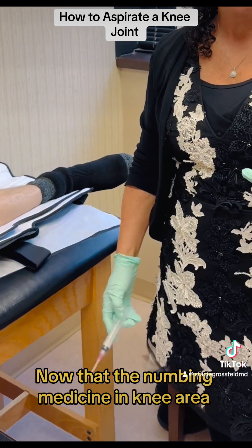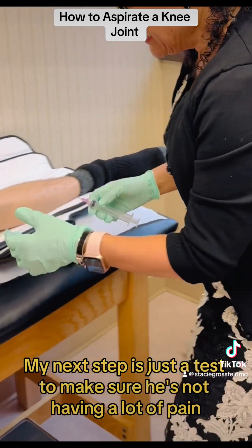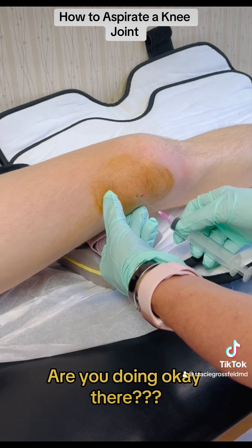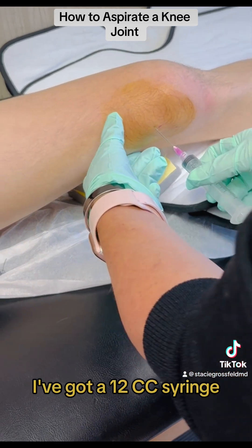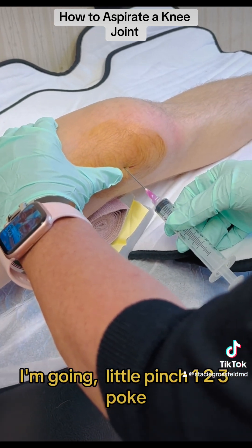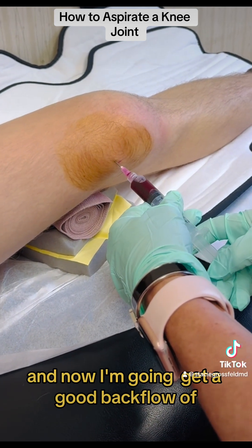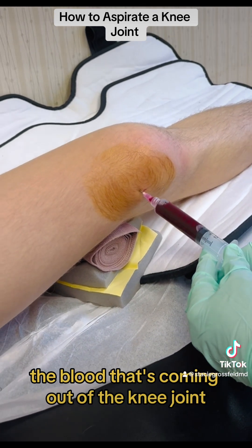Now that the numbing medicine is in, my next step is to test to make sure he's not having a lot of pain. I'm going to push here — you should feel pressure but not a lot of pain. This is an 18-gauge needle and I've got a 12cc syringe. One, two, three — poke. I can feel that I popped through the capsule and now I'm going to get a good backflow of the blood coming out of the knee joint.